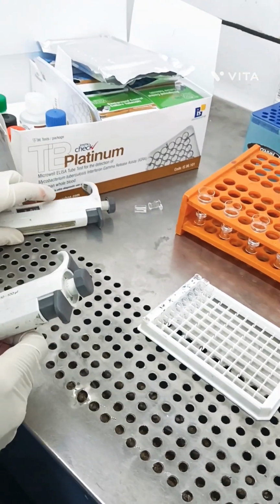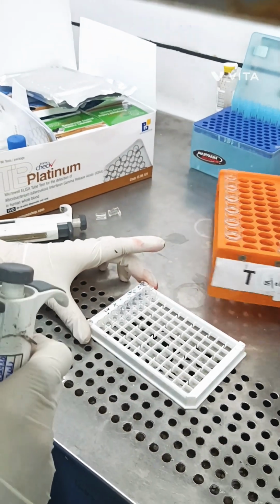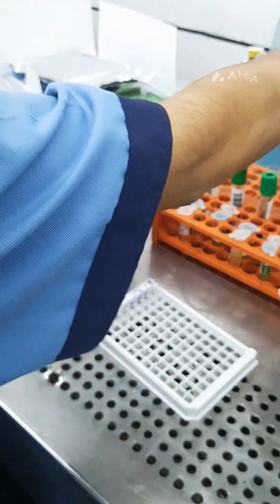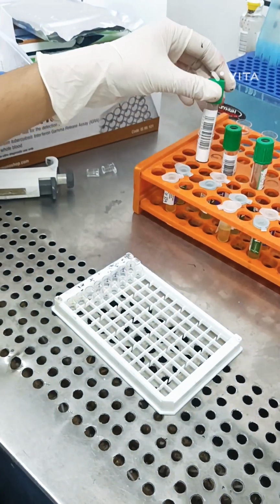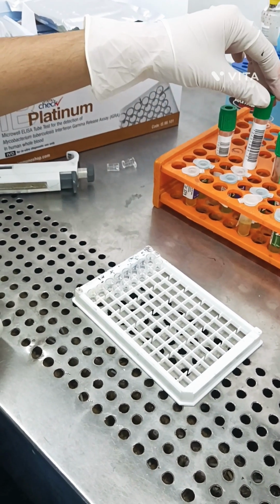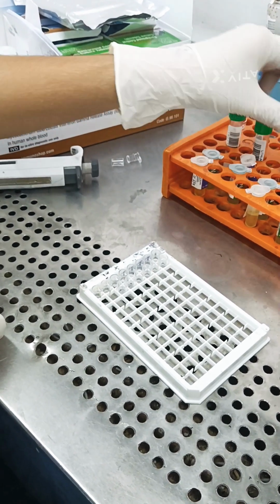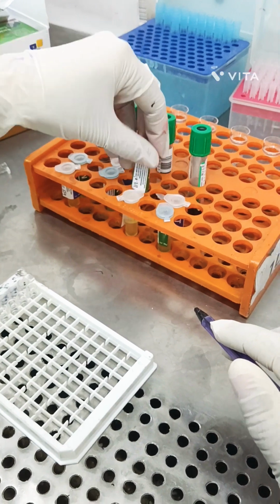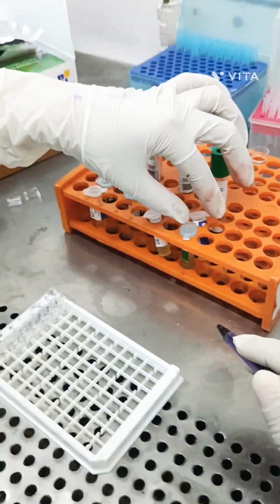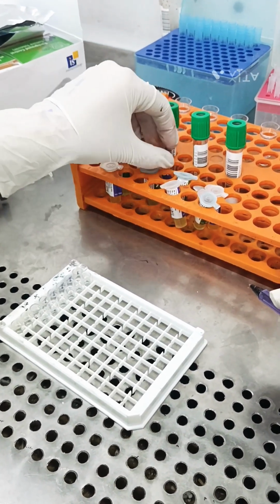If you have 2 samples, 1 sample or 4 samples, take as per samples N and T control wells, and transfer first 20 microliter of sample dilution buffer. First we have to check that the IDs are different for T and N tubes, so correct this.